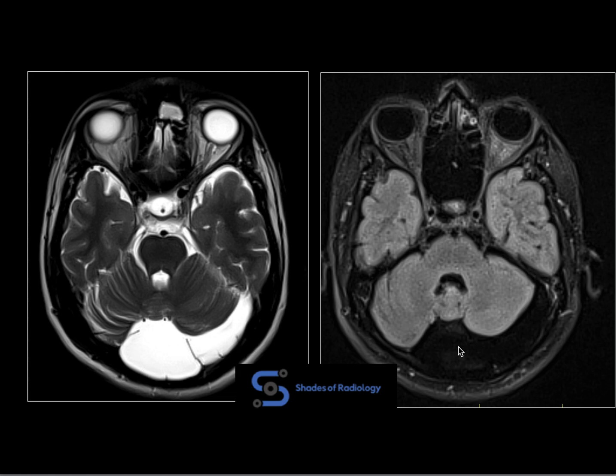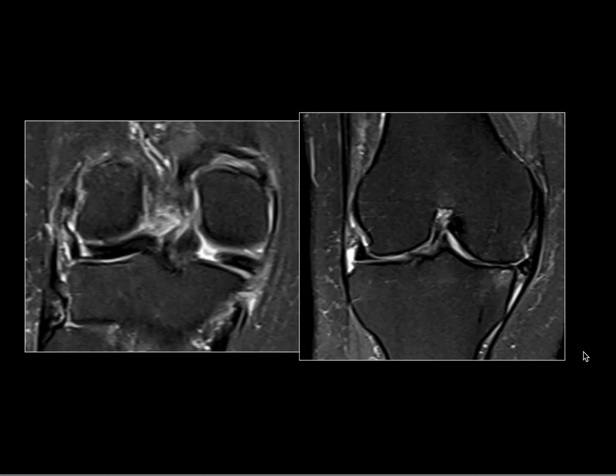Large posterior fossa arachnoid cyst, which is completely suppressed on FLAIR. You can see some amount of scalloping over the cortex — another classic one.